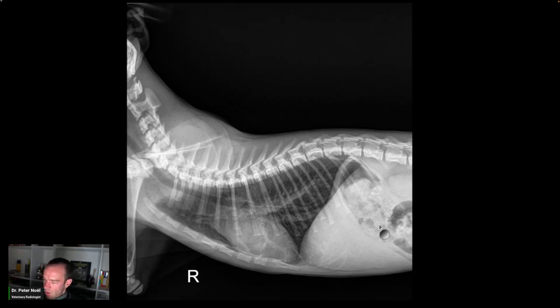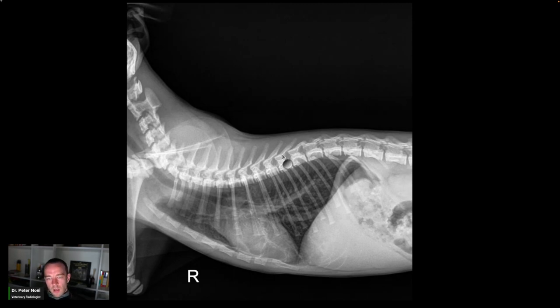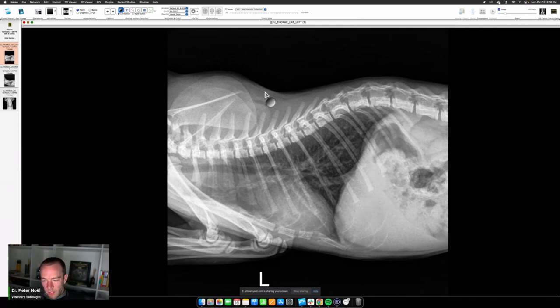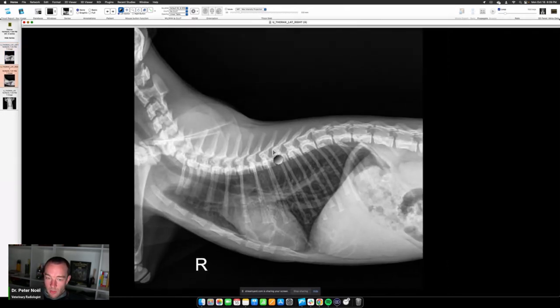Any questions or concerns? Pretty straightforward. One comment was about a large liver — young cats and young dogs have a liver that looks big relative to body size. That's a game you have to play: is it too big for the age of the patient? I think this is totally fine. He's a really young cat, so the cardiac silhouette always looks kind of chunky and the liver always looks too big.